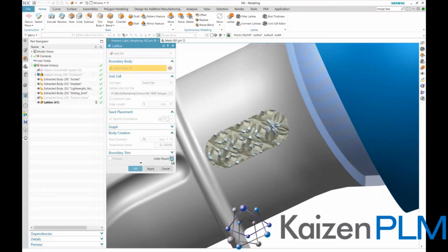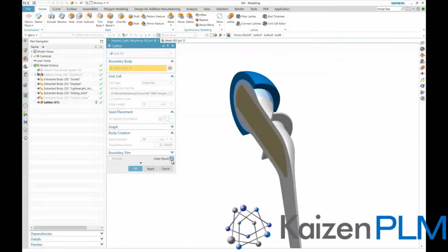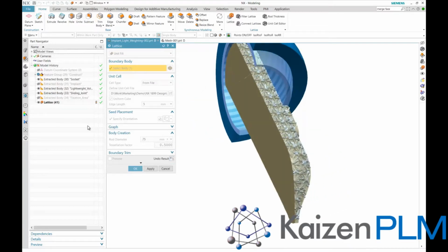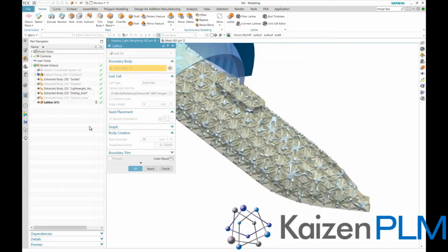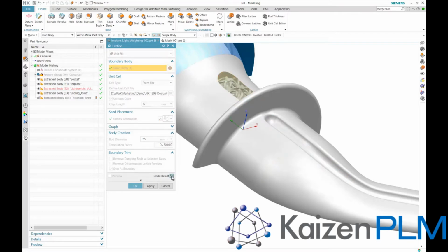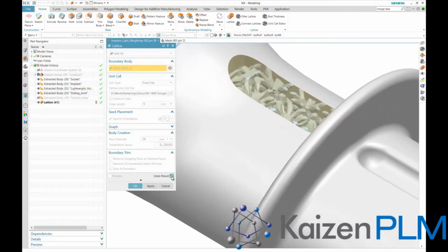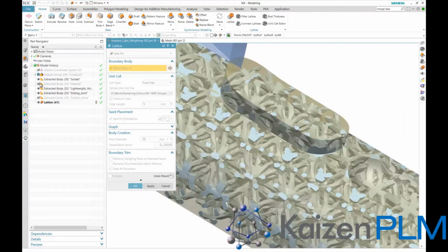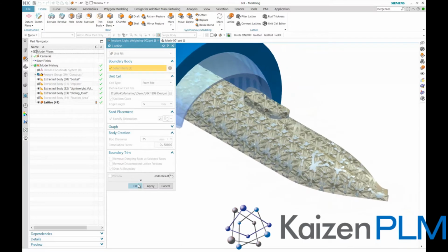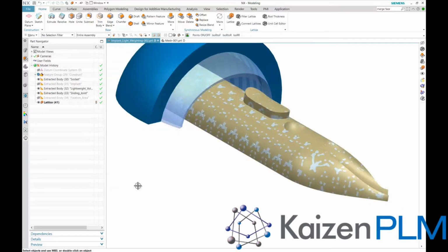Reviewing the lattice by using Show Result, we see that the lattice is somewhat poking through the volume defining it. Should this be undesired, this version of NX now offers the capability to limit the lattice to the boundary volume by using the option Snip at Boundary. As usual, we execute the preview and review the lattice fill level of the defining volume. As the result is up to our requirements, we confirm and accept the lattice creation.